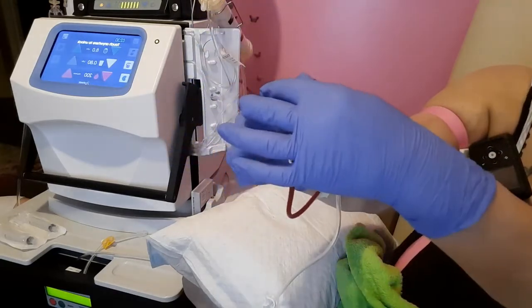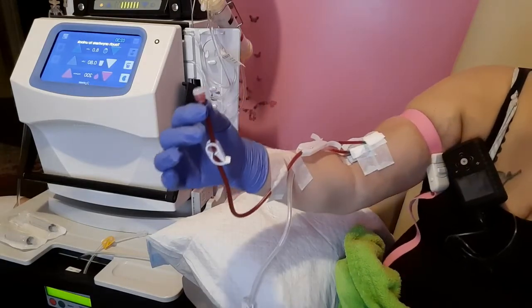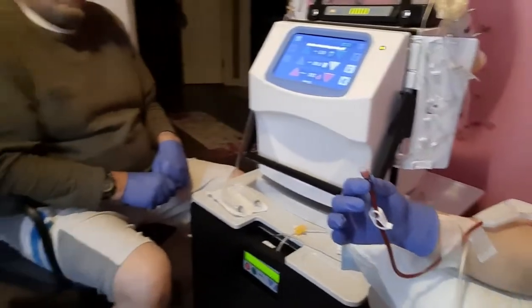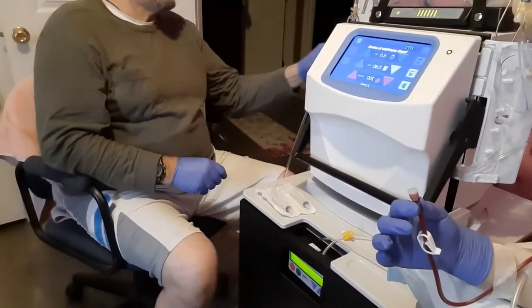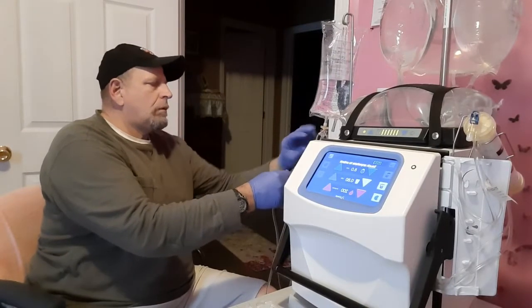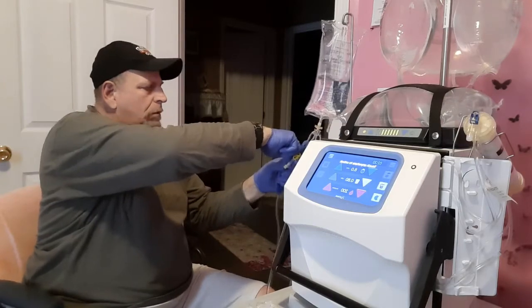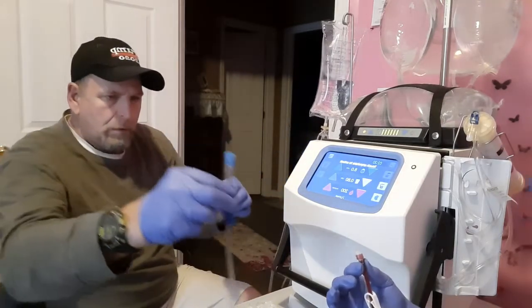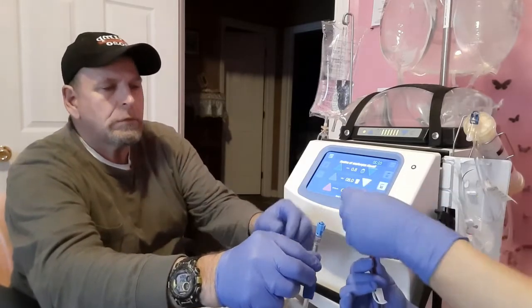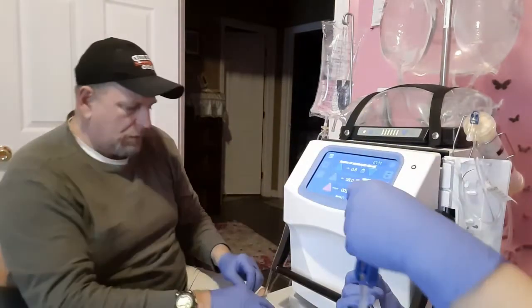Okay, so now we tighten the cap, we're going to clamp the line, and now Hofstra is going to disconnect the venous line from the saline bag. He's going to clamp top and bottom, disconnect the line, he's going to pass it to me while his hand is out, because he's going to grab this little cap and put it in the sharp container. I'm going to take the venous line.